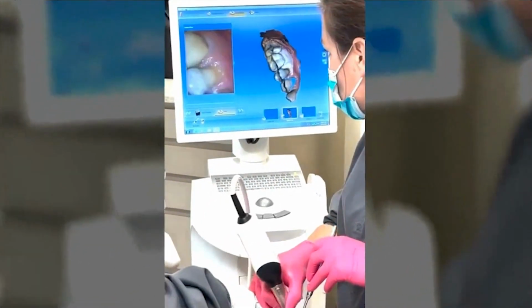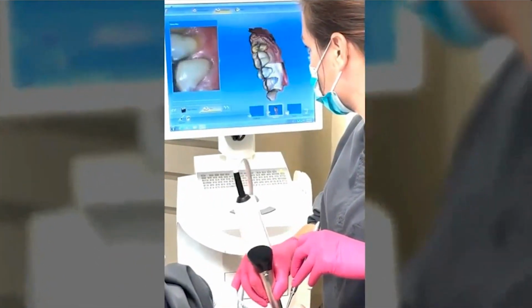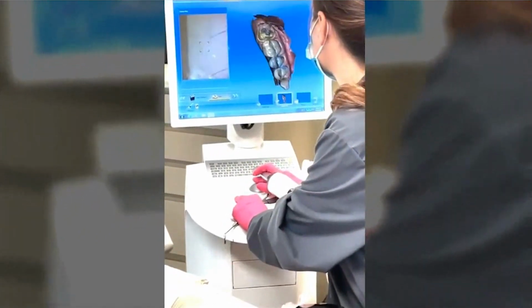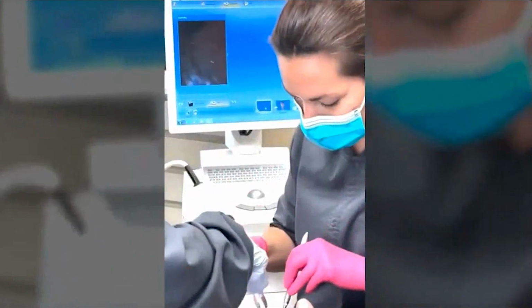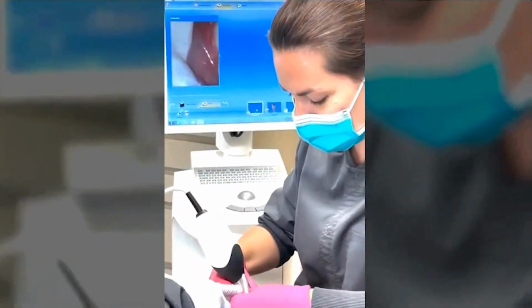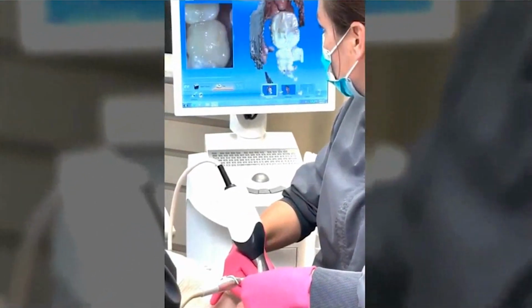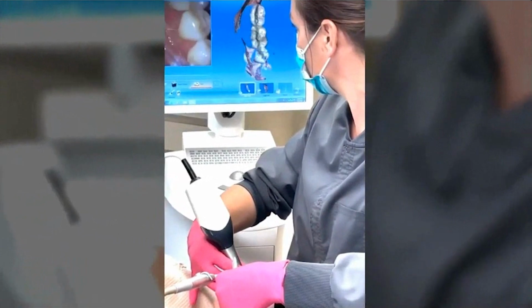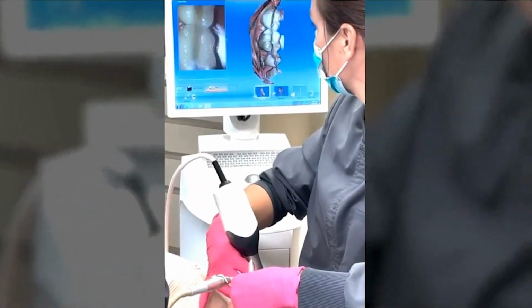And the most important thing to get is your prep. You want to get the contact of the adjacent teeth, the occlusals, and the buccal surfaces as well to line up your bite afterward. And I just go down and switch to the opposing arch. On the opposing arch, you just scan along to get the occlusal surfaces and then come around to get the buccal surfaces here.